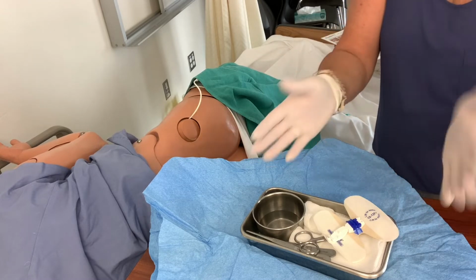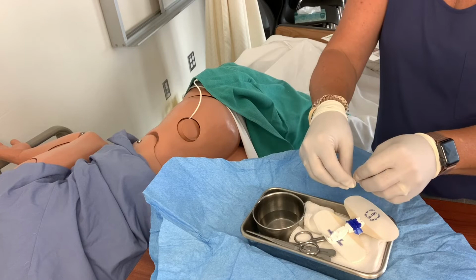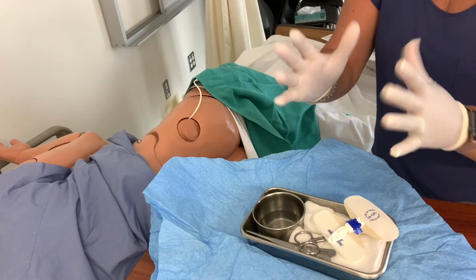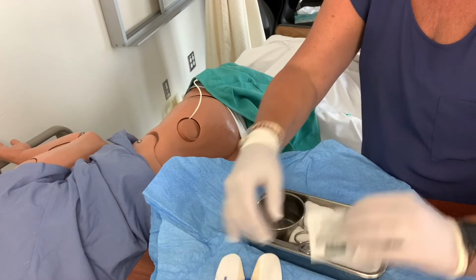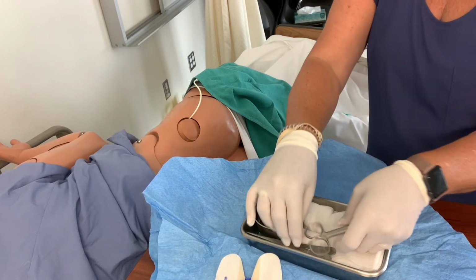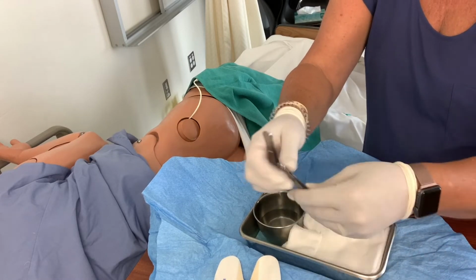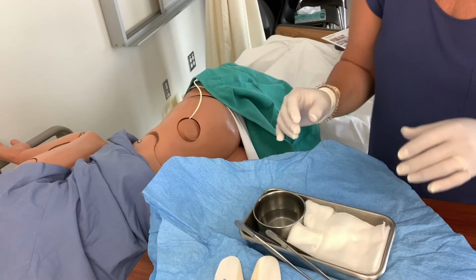So I've added my supplies. My saline is in there. I'm good to go. I then added my sterile gloves, so this is the point that I'm at. Here is my StatLock device, and here is a skin protectant pad. All my utensils are on the inside because I'm wearing sterile gloves, so I can certainly move them anywhere as I need to right now, but I cannot put them in the 1-inch border, so I'm just going to keep them on the side of my tray.